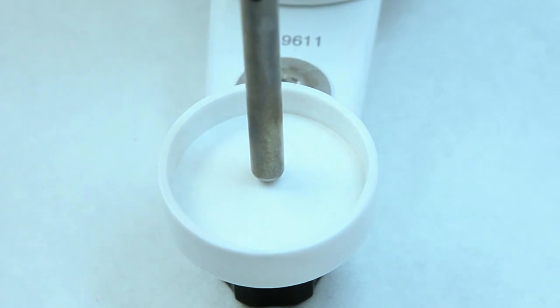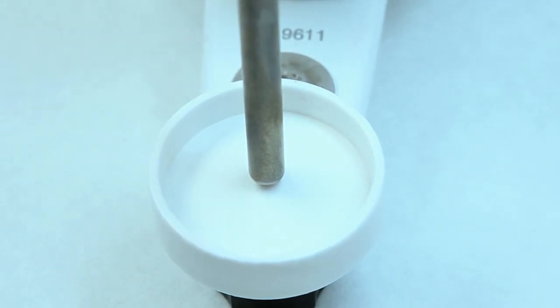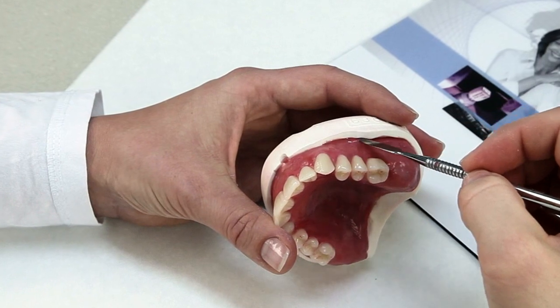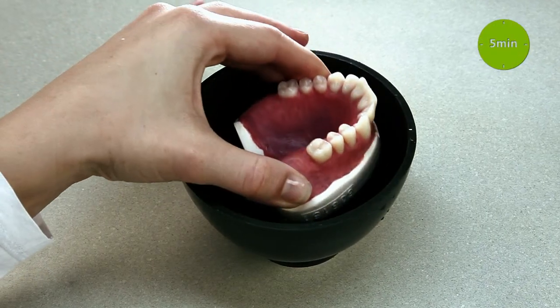At the same time, the support pin should contact the tray. After that, secure the denture body with wax and store the model in a water bath for 5 minutes.